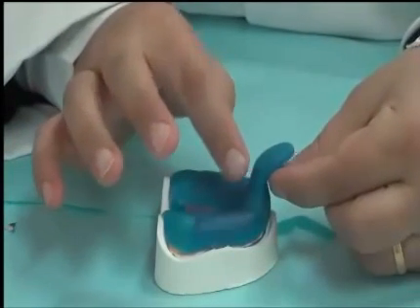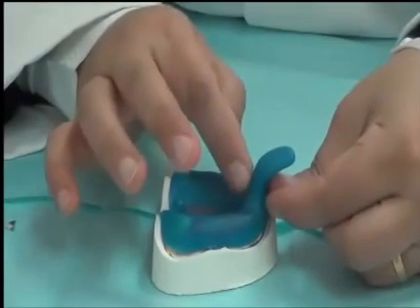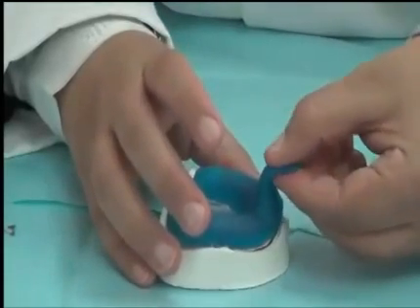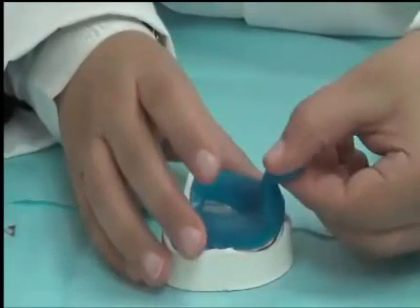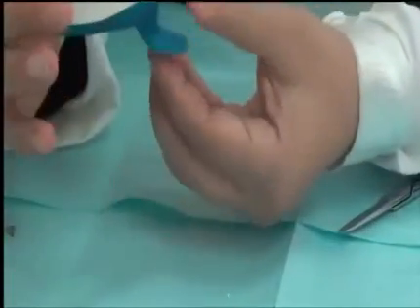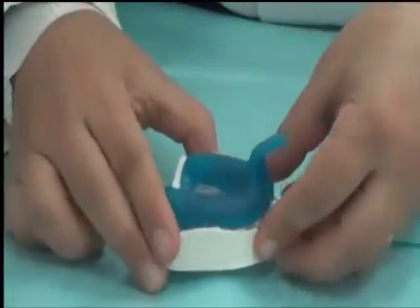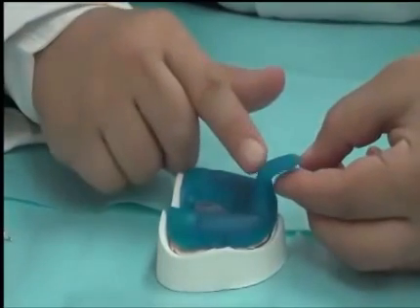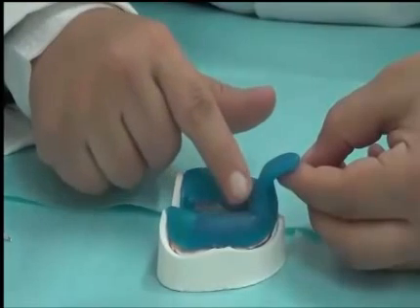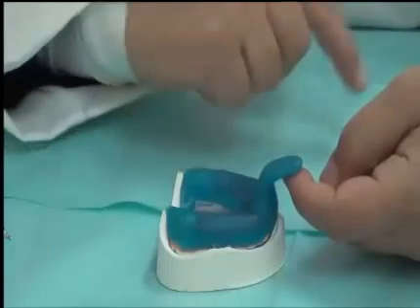The body goes up vertically, or a bit labially, it's okay, but vertically is safer. And then, on the last bit of it, it bends to the outside and becomes flat. This provides a grip for the dentist when he's holding the tray in and out of the patient's mouth. So if this is the patient's upper mouth, the dentist has a grip to hold the tray and put it there. Now this is ready to be light cured inside the light cure unit. But keep in mind that sometimes the light cure material you're using might flow back down, so we might need some support here to be placed inside the light cure.